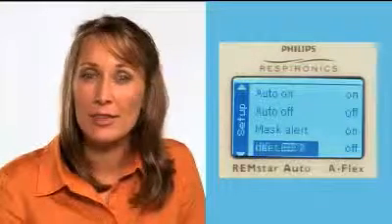If you engage the Auto On feature, the airflow will start automatically when you put on your mask. Auto Off will turn your device off when you take off your mask. Mask Alert enables an audible and visual alarm that will let you know when there is a significant mask leak. Finally, the LED backlight lets you decide if you want to keep the humidifier icon and settings constantly visible.